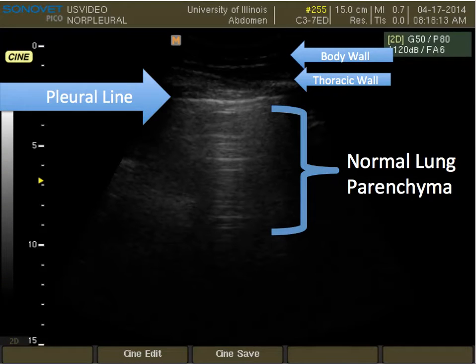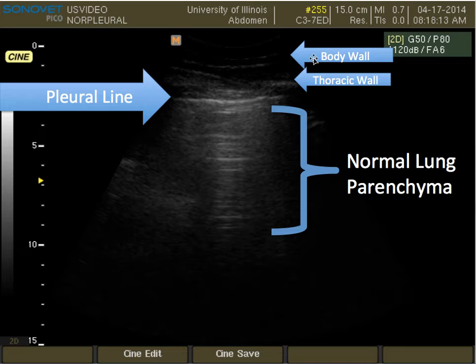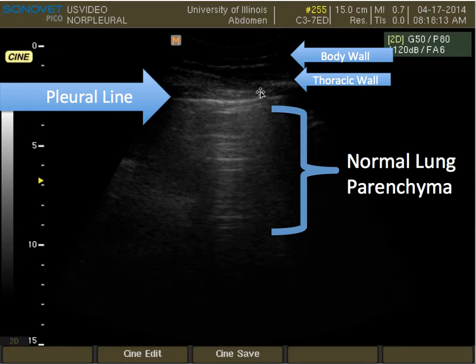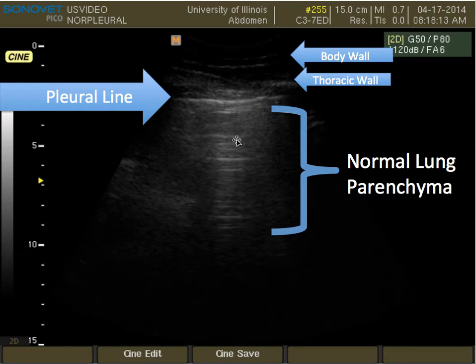The next three slides are going to be ultrasound pictures of a normal looking lung. The first part you're going to see is the body wall. Just below that is your thoracic wall, and just below that is this shimmery white line called the pleural line. Just below that is your normal lung parenchyma — this is what a normal lung looks like. You may notice there's streaking here, but that is actually normal. It's very normal to see streaking in a normal lung.